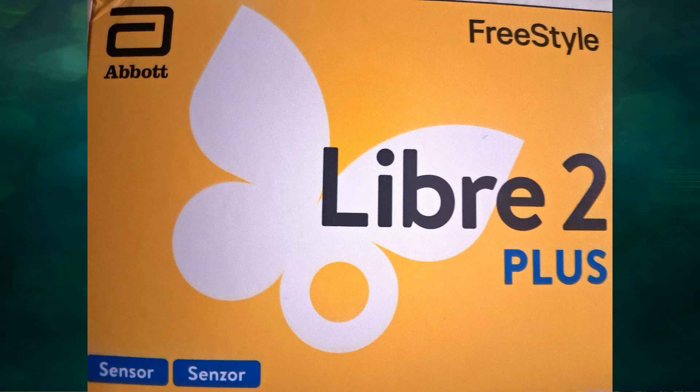As we all know, we live in a modern world — we don't use glucose monitors anymore because it's painful. We've moved into the sensor world. The first generation is called the Libre 2 sensor, and now there's the Libre 2 Plus. The difference: Libre 2 was a flash glucose monitor, meaning you had to scan each time to get a reading. The Libre 2 Plus is a continuous glucose monitoring system (CGMS), meaning you don't have to scan — your readings are automatically sent to your phone.